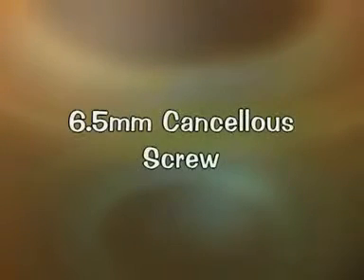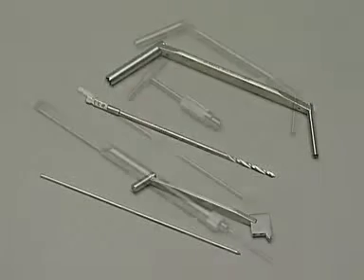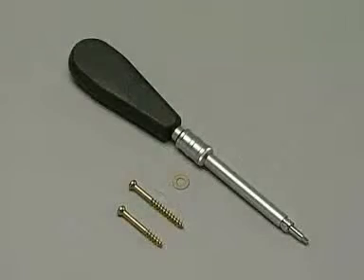For the 6.5 millimeter cancellous screw applied to the medial tibial head, required are a K-wire with a triple drill guide, the 3.2 millimeter drill bit with the double drill sleeve 6.5/3.2, the large depth gauge, the 6.5 millimeter tap with T-handle, and the double drill sleeve 6.5/3.2. 6.5 millimeter cancellous screws with short and long threads. A washer and a hexagonal screwdriver with corresponding holding sleeve.